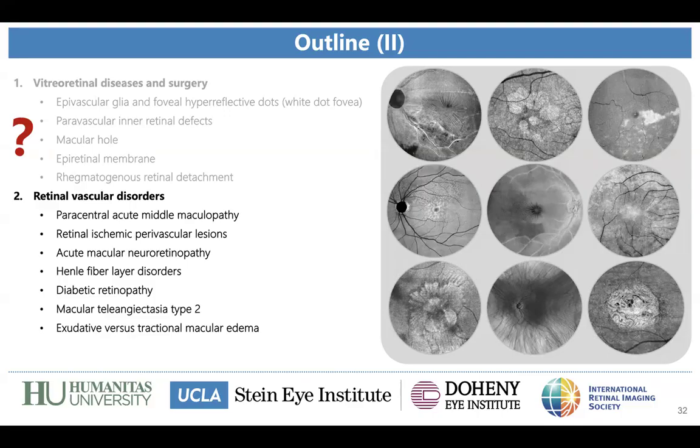I remember that we used to make measurements of the ellipsoid area, because when you're using just a B-scan, a cross-section, you are not going to have the whole extent of the ellipsoid zone. So it is really important for following patients with those kinds of diseases, and also for research when you're studying new drugs.